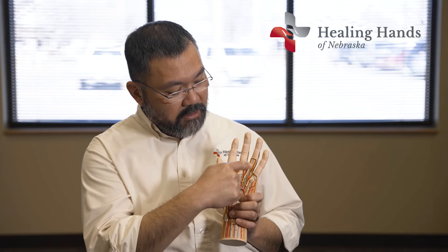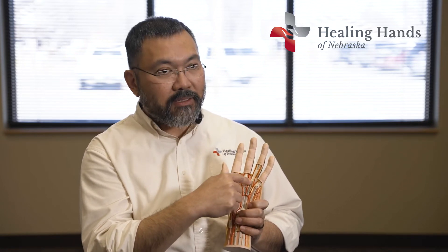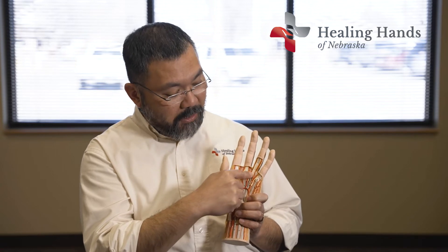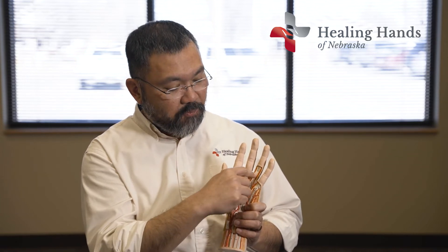Patients say that when it pops, it hurts right here in the palm of their hand. You can see here's the tendon, and this is the pulley. When you close your hand, that tendon slides down into the wrist. If there's a knot in the tendon from inflammation, that knot will pop out of the sheath, out of the pulley, and when you try to open your hand it gets stuck trying to go back in — and that popping sensation is from forcing it back in there.